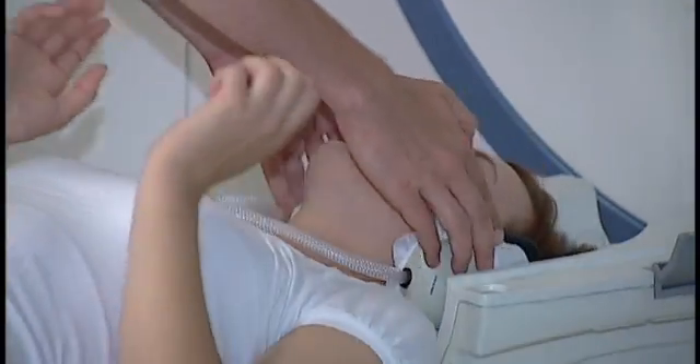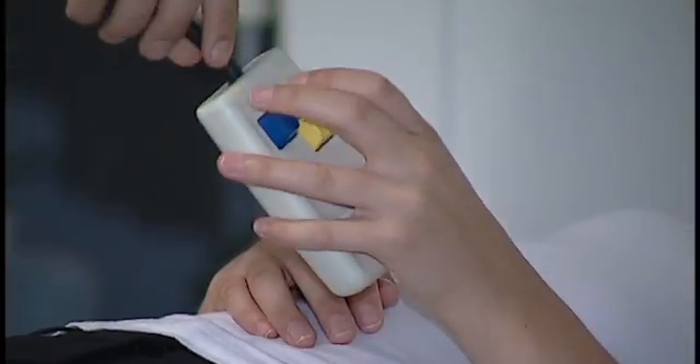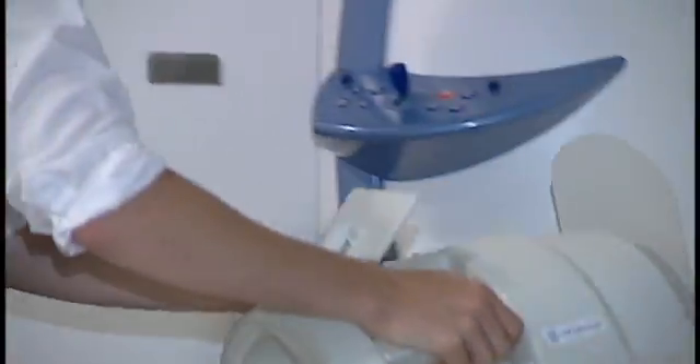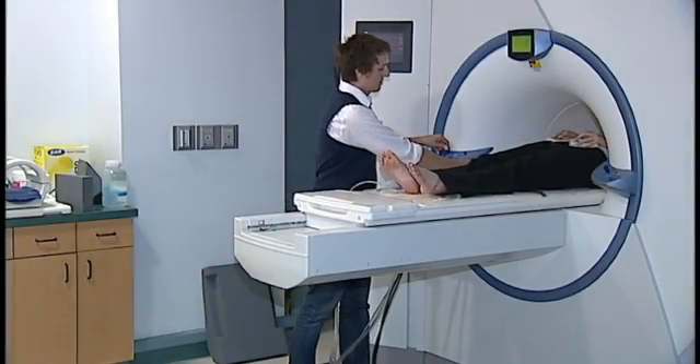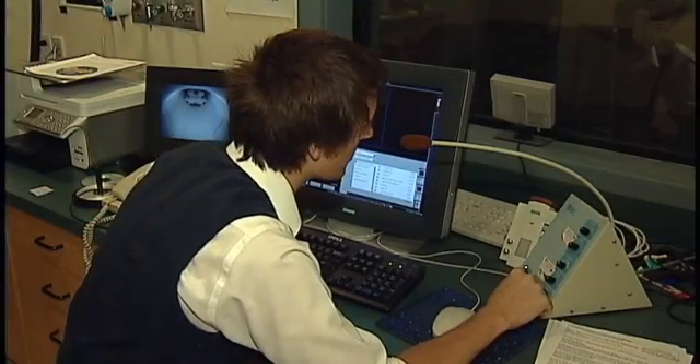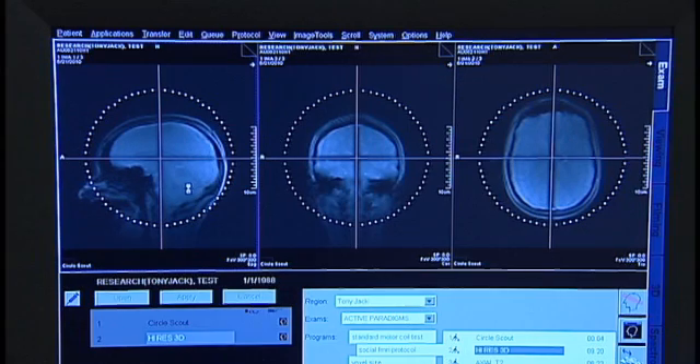The participant gets headphones to hear over the scanner noise, keypads for response, and a visual input through a projection screen mounted on the head coil. This is viewed through a mirror. After the participant has been positioned in the magnet, communication is achieved through the microphone.